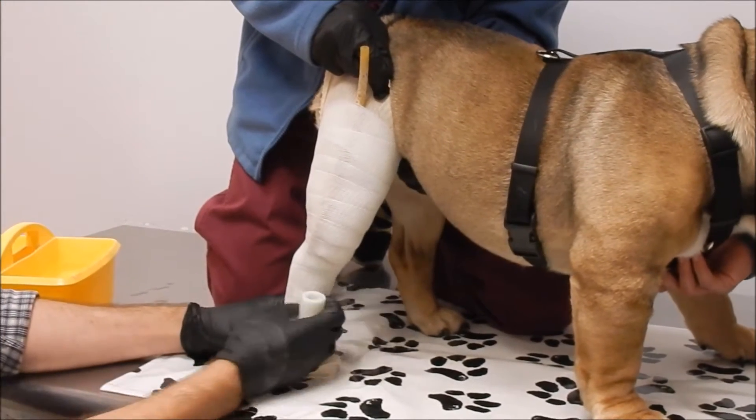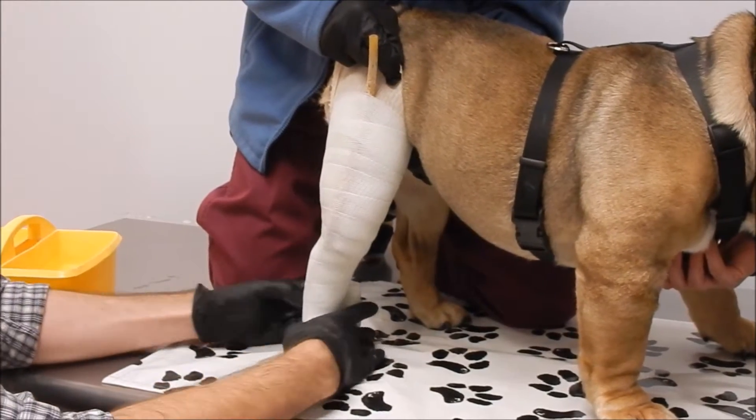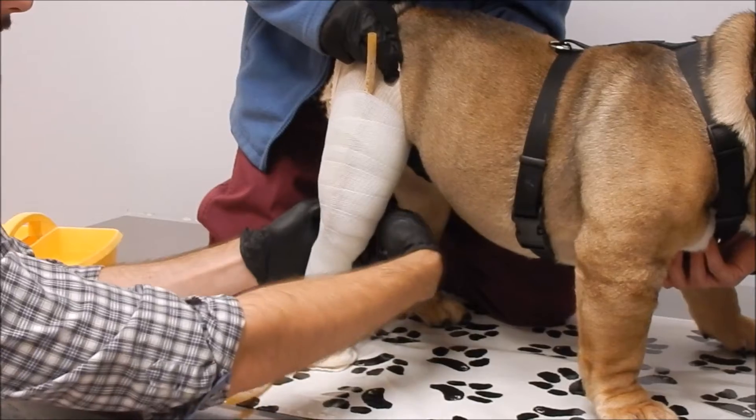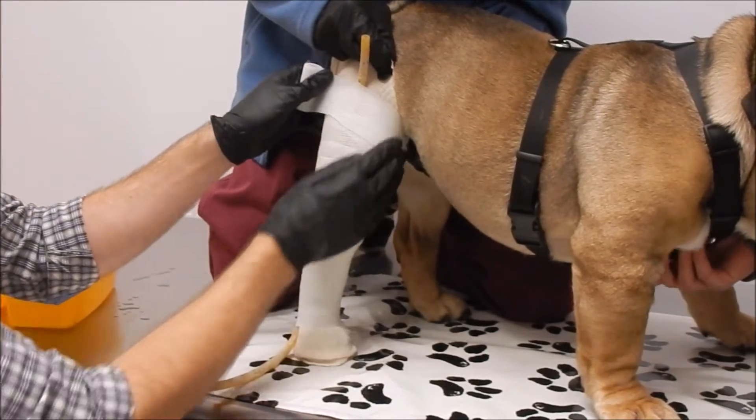For Zeus, I want to make sure I have a good angle at his hock. If the hock was too straight, it'd be really tough to make our brace. I'm going to get good definition of his quadricep.